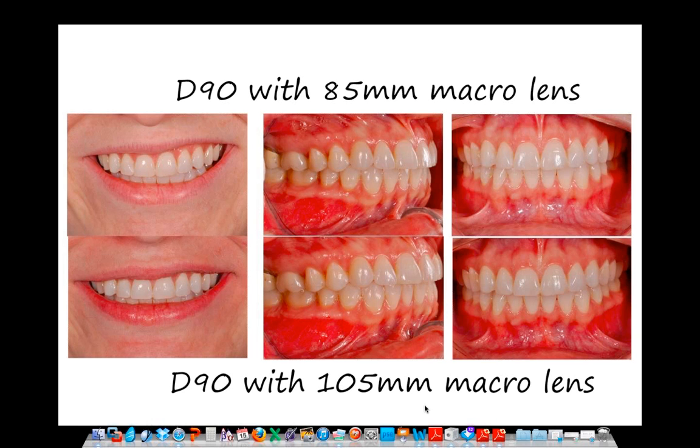If you try to take your zoom lens, and many, many, many people who come to my courses have brought their zoom lens, meaning it's got a dash in it. It goes 18 to 50 or 28 to 200 or 50 to 105. Those are zoom lenses. They're not meant for dentistry. As far as I am aware, there is no macro lens that's truly a zoom that has different millimeters in it. So you have to have a fixed lens, and it has to have the ability to do macro, meaning get up close. If you don't have that, you're already fighting an uphill battle.